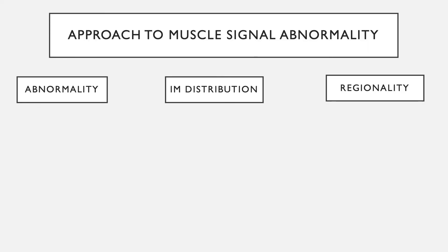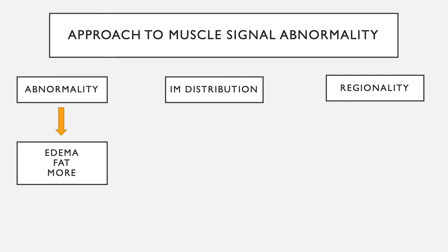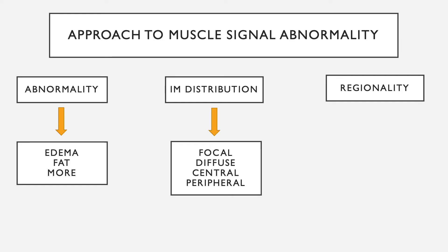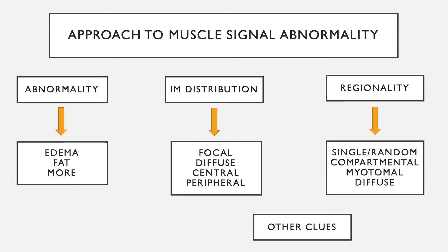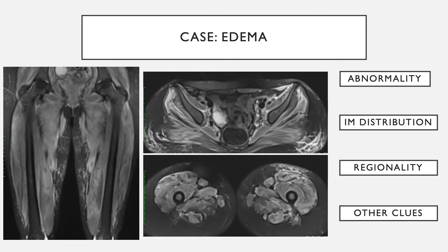To summarize, when looking at muscle abnormalities, we look for the abnormality — is it edema, fat, or something else? We look at the intramuscular distribution: is it focal, diffuse, central, or peripheral? We look at the regionality: is it a single muscle, a random muscle, a compartment, a myotome, or rather diffuse involvement? And then we look for other clues. Let's look at a few cases to get our heads wrapped around looking at muscle edema.